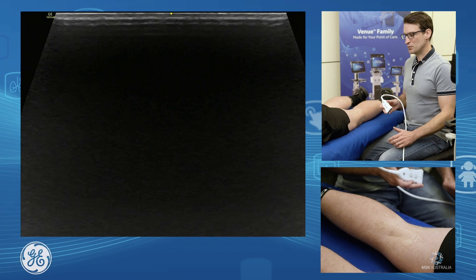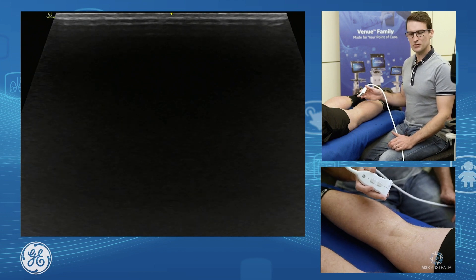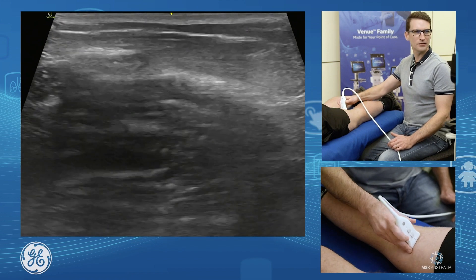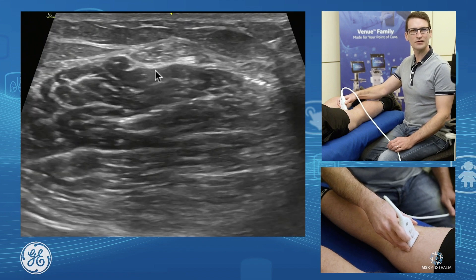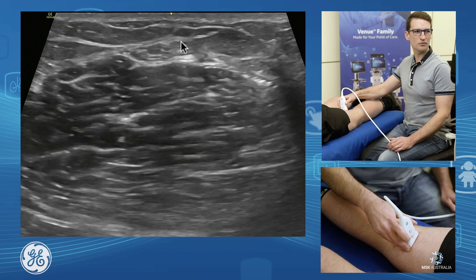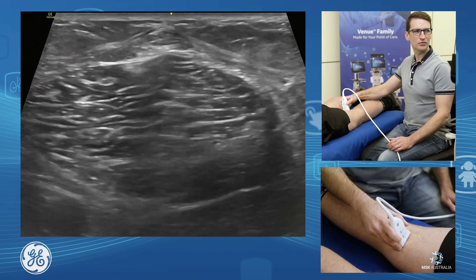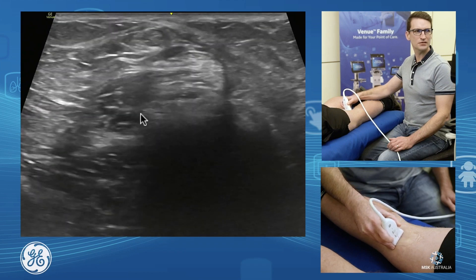The posterior knee — we're going to pick up our two medial hamstrings. We'll be on the posterior thigh, medial aspect. What we'll see here is almost like the cherry on the pudding. We'll have our semi-tendinous tendon sitting up over the top of our semi-membranous muscle bowl. As we follow that down, we'll start to have our semi-membranous form its tendon.